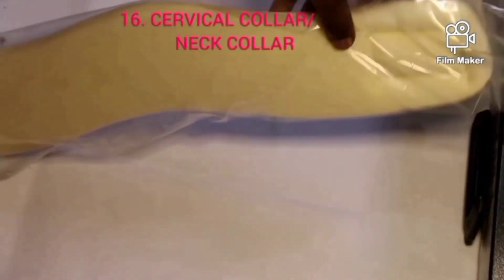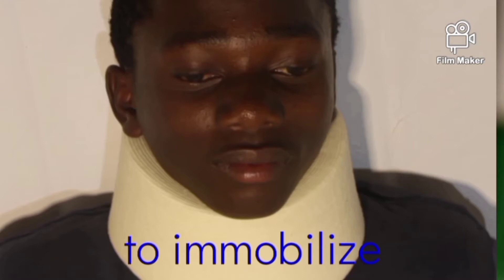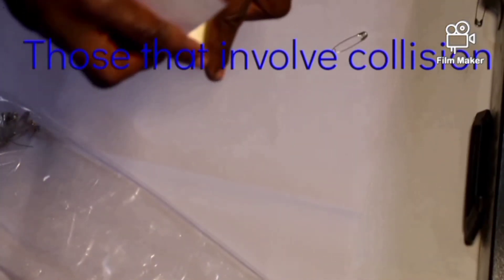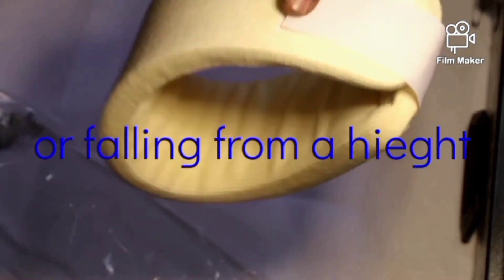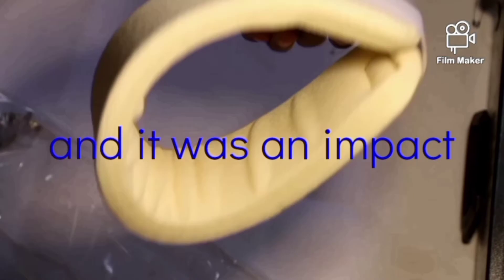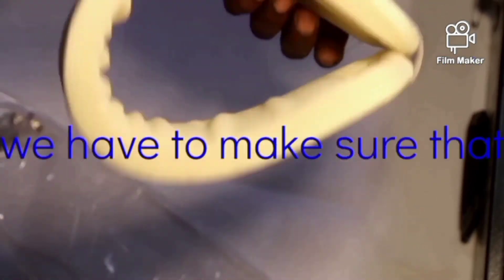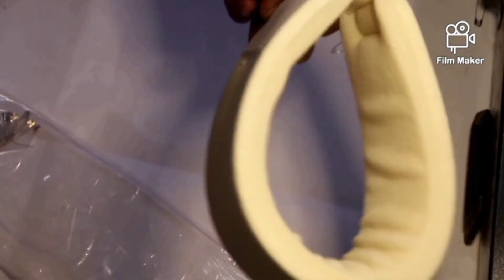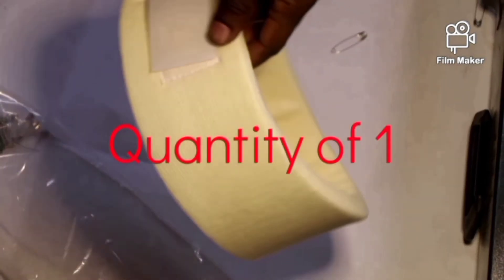This is a cervical collar. It is an instrument used to immobilize the spine at the back of the neck. If a patient has been involved in an accident — especially those involving collision or a fall from a height with impact — before we handle the patient, we have to make sure the neck has been immobilized so it is not moving from side to side. We apply this cervical collar. It comes in a quantity of one in the first aid box, though we can have more.